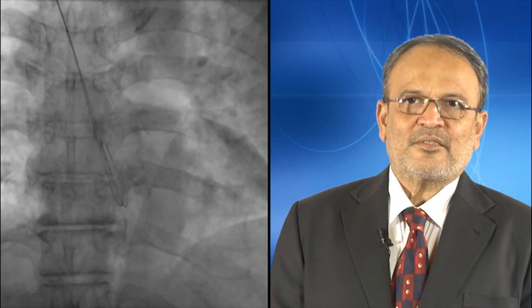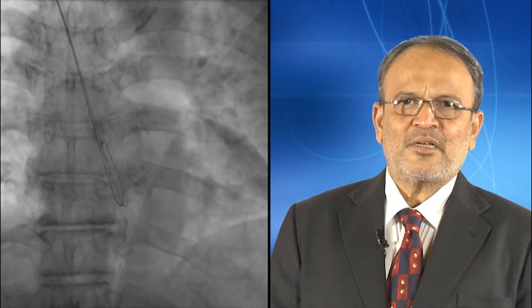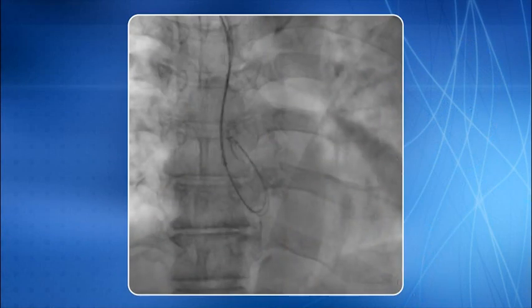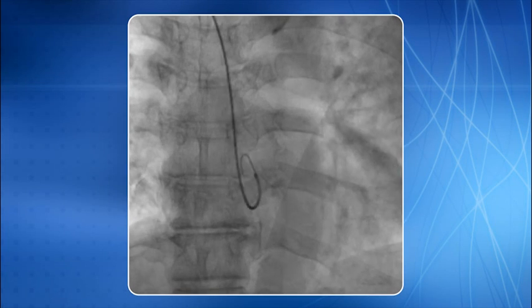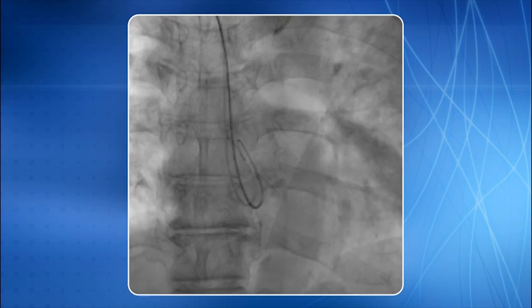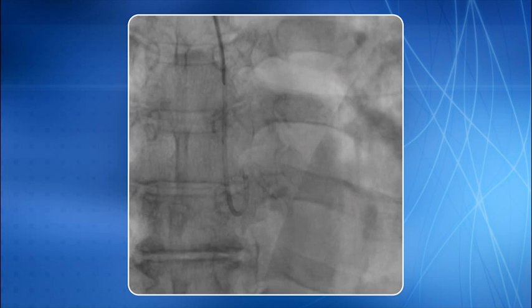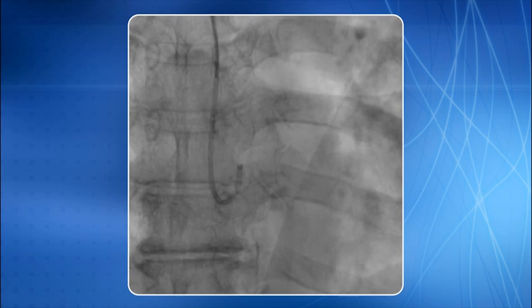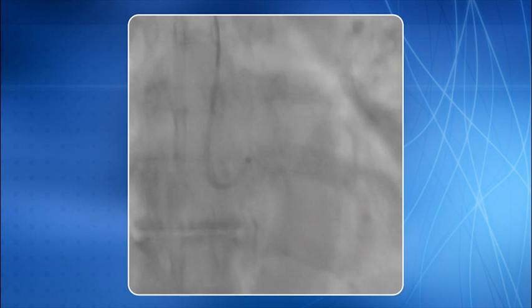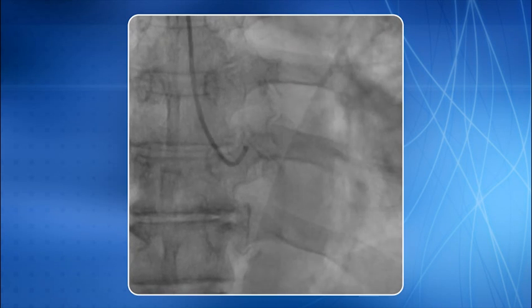I will now show you the left coronary cannulation using the left Judkins catheter. A standard 0.035 inch guide wire is kept in the ascending aorta keeping a loop. The left Judkins diagnostic catheter is negotiated over it. The guide wire is removed inside the catheter. A slow pullback of the catheter is started, and the LCA ostium is cannulated.